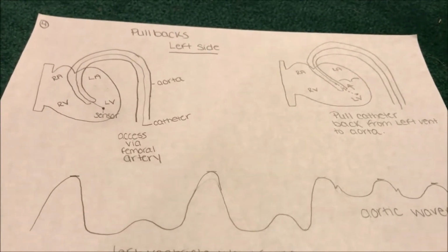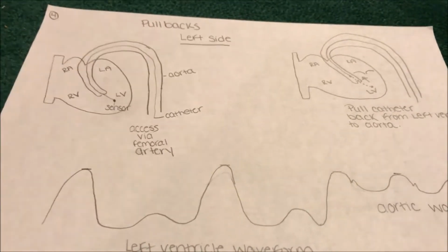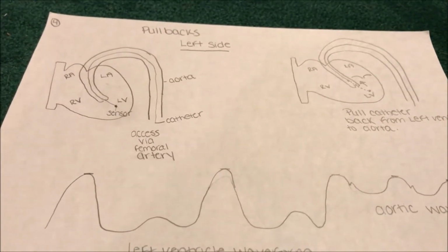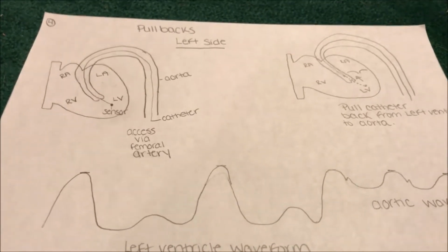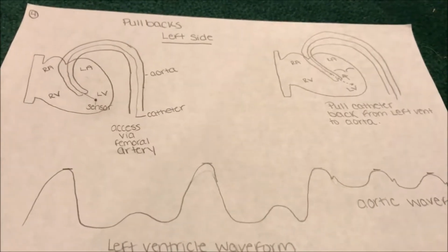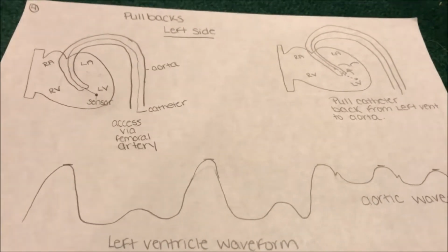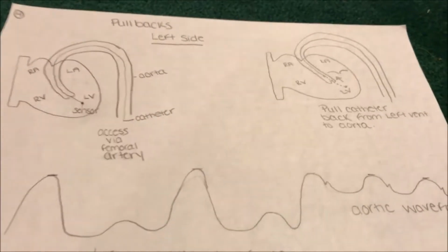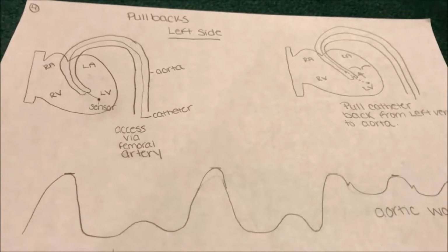And we'll talk about the different correlations, but there should be a correlation because at one point when the valves open, you have a common chamber between two different places. So the common chamber should have an equal amount of pressure. If it's the systolic, diastolic, or even if it's the mean, there should be some correlation between the two chambers at a given point. So we're going to start with the left side of the heart.